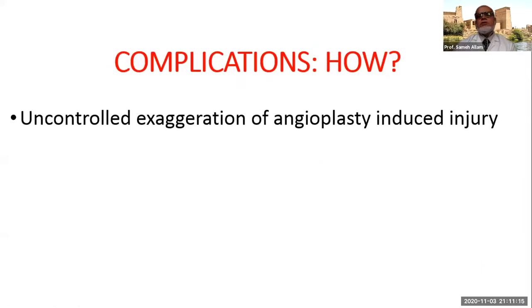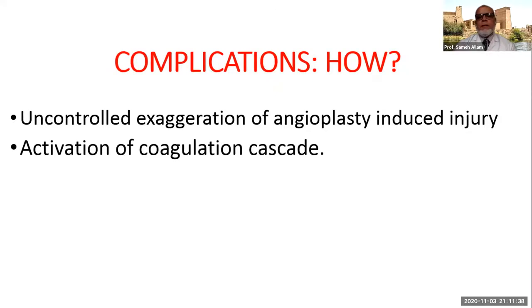Now, why do complications occur? What is the mechanism of occurrence of complications? Uncontrolled exaggeration of angioplasty-induced injury. So to open a vessel, you will cause a reasonable injury for a therapeutic purpose. To prevent the complication, keep this angioplasty-induced injury under control. Balloon to vessel ratio: how much balloon should I use, how long is the balloon, to which pressure should I inflate the balloon, and which type of balloon am I using.